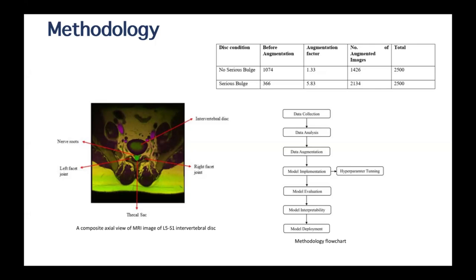So the total images summed up to around 1,470 after our analysis. Then we did what we call data augmentation, which is a way of generating fake data from an original data set. This was done to increase the sample size so that our model can learn better.